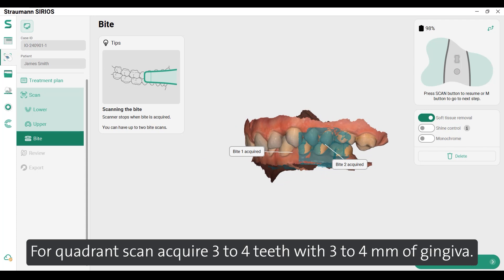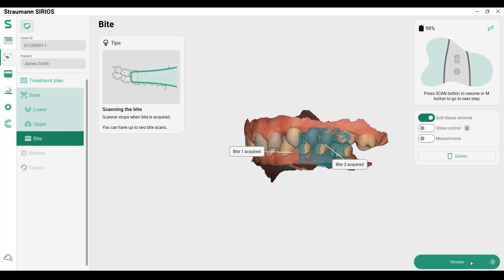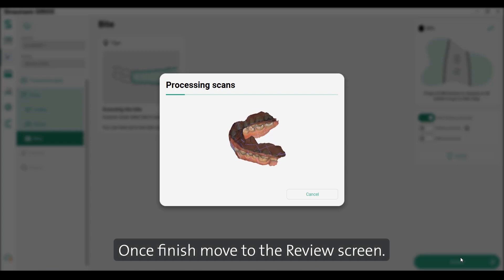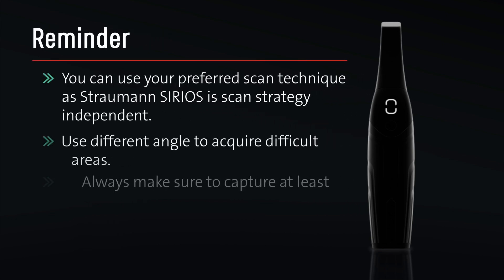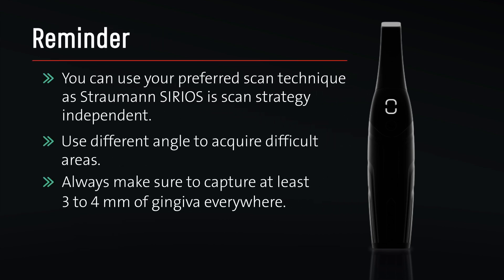For a quadrant scan, acquire three to four teeth with three to four millimeters of gingiva. Once finished, move to the review screen. Reminder: you can use your preferred scan technique as Straumann SIRIOS is scan strategy independent. Use different angles to acquire difficult areas and always make sure to capture at least three to four millimeters of gingiva everywhere.